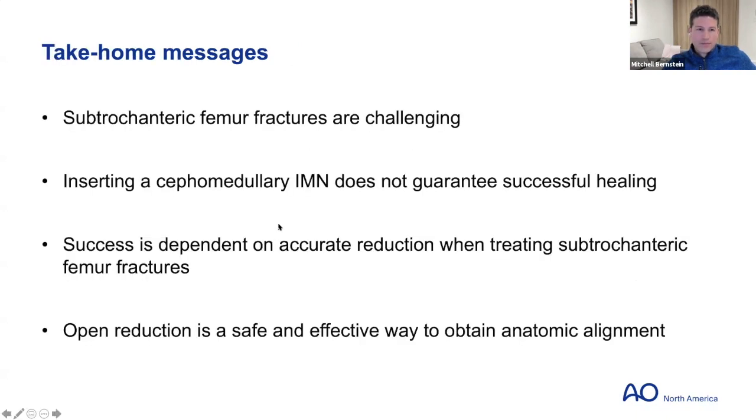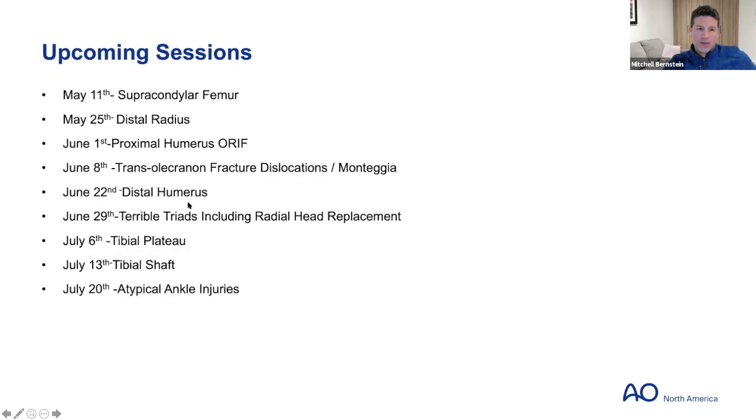Take-home messages, like Jeff mentioned before: subtroch femur fractures are challenging. Inserting any type of cephalomedullary nail does not guarantee successful healing. And I think we talked about success being dependent on accurate reduction when treating subtroch femur fractures, and open reduction is safe to get your alignment.